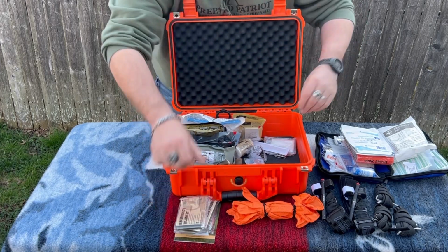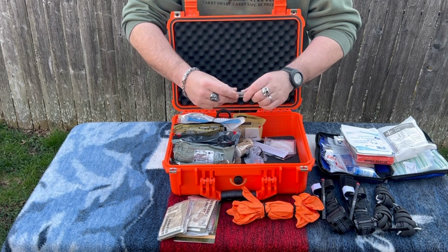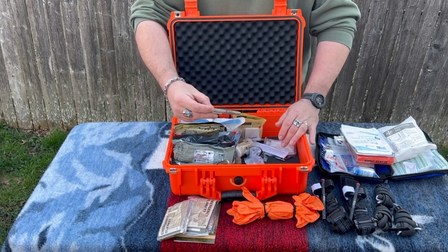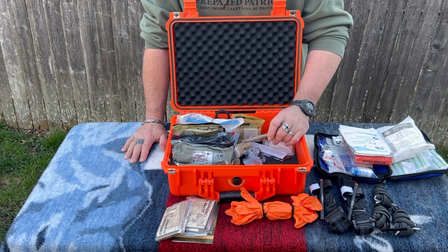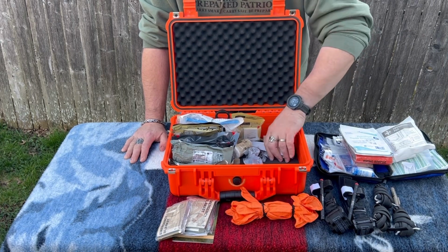Another emergency blanket. What else is in here? Sharpie. It can't hurt. I know everyone includes it for the time on tourniquets. I understand that, and it's also information that EMS is going to want to have. I don't necessarily think it's as important as people put it out to be, but it's there.